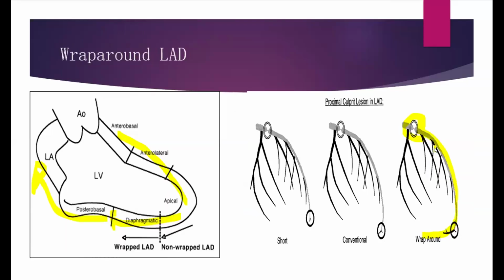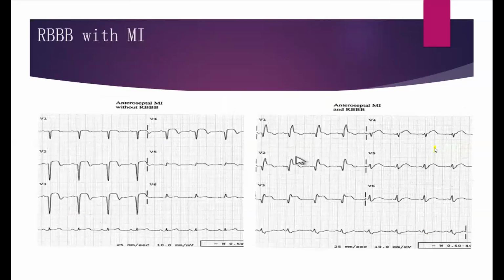Okay, so this STEMI occurs in other conditions, such as when you have changes already in the QRS, such as when you have an RBB or LBB. So in RBB, when you have STEMI, what happens is that you have RBB, you have the rabbit ear. Okay, so these are two ears. So when you have RBB, that is a right bundle branch block, you have the disappearance of the first ear. So you get something like this instead of the rabbit ear. This is generally just to tell you that it is possible. It's likely beyond the scope of this class.